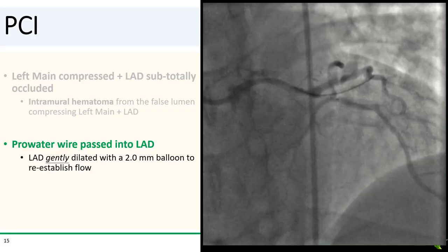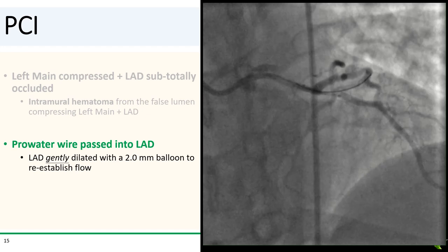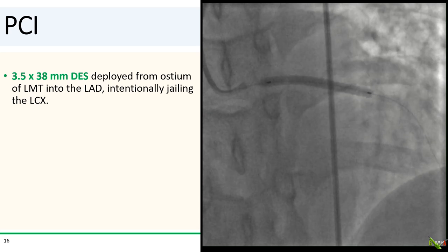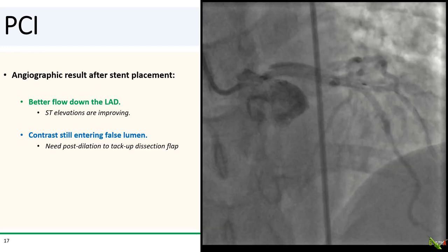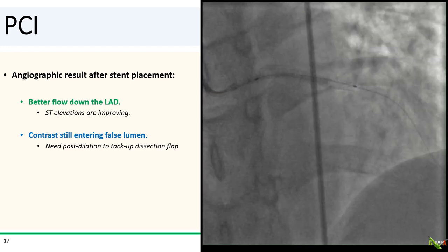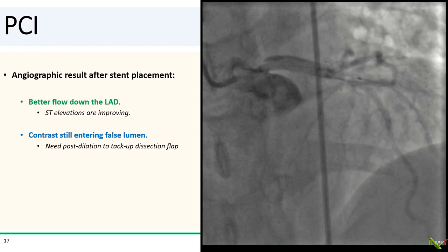So with the pro-water wire down in the LAD, the LAD was gently dilated with a 2.0 mm balloon to re-establish flow. A small balloon was intentionally used here to avoid squishing the intramural hematoma further down the vessel. A long 3.5 by 38 mm DES was then deployed from the ostium of the left main into the LAD, and that intentionally jailed the circumflex. After stent placement, there was better flow down the LAD. The patient's chest pain improved and his STs are improving. There is still contrast entering the false lumen in the left main, so the dissection flap has not been fully tacked up yet, and some post-dilation is going to be needed.